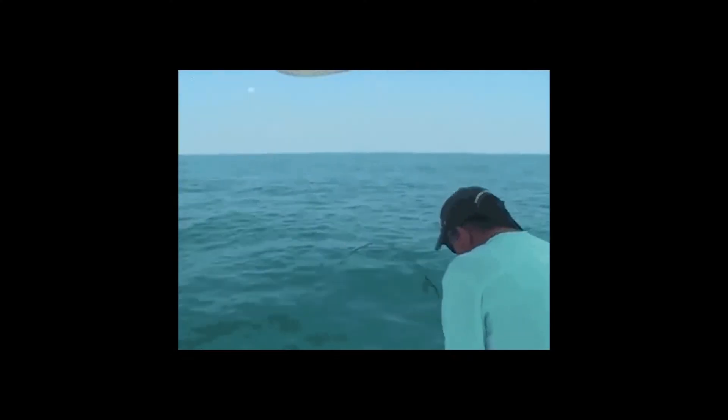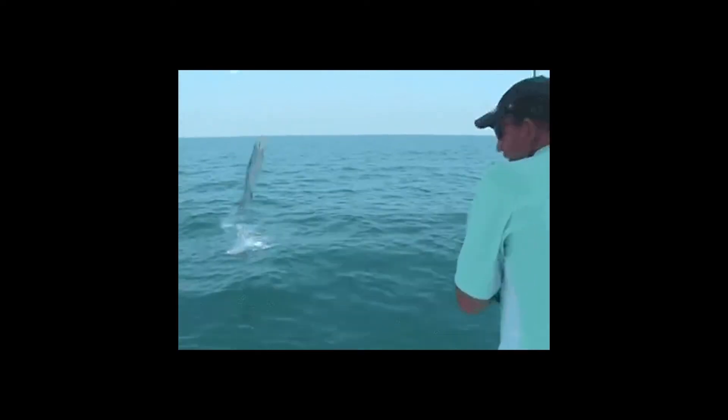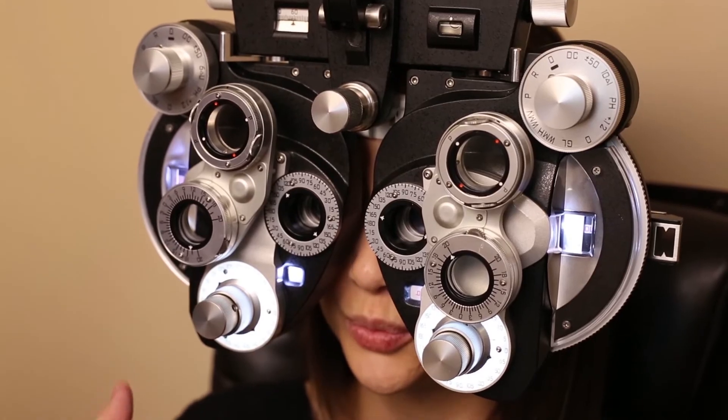If they pick two at any point, that means we have a catch on our fishing trip for astigmatism — they have some astigmatism somewhere near that axis. Now we must fine-tune that axis. Just like with spherical power, we go from big coarse changes down to fine-tuning. With axis of astigmatism, we've found where it is in general and we fine-tune to find the exact degree of astigmatism.